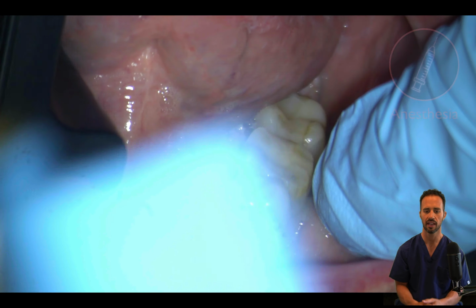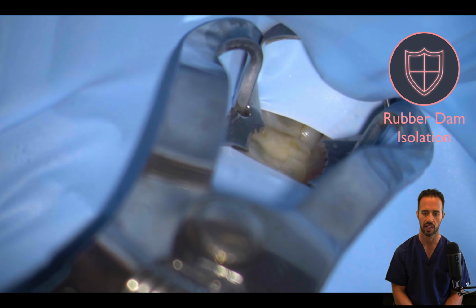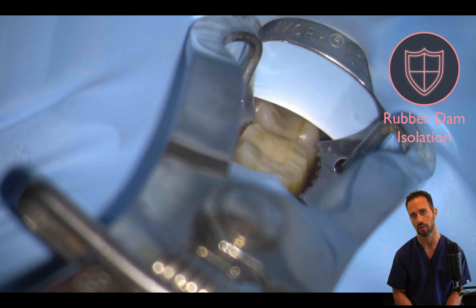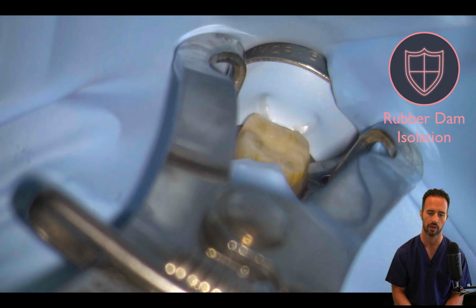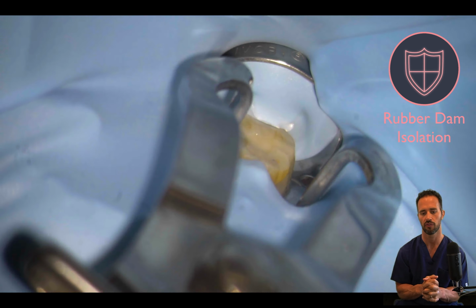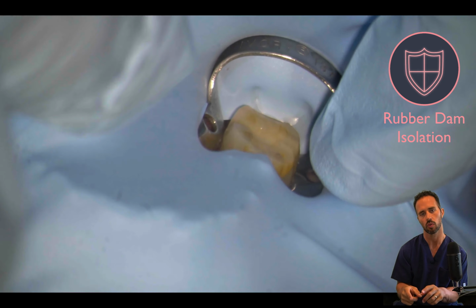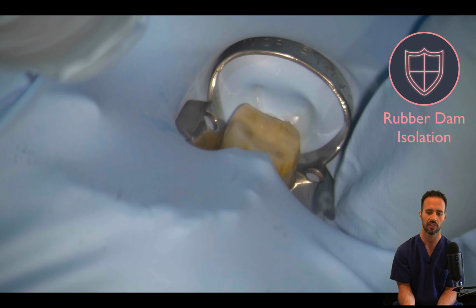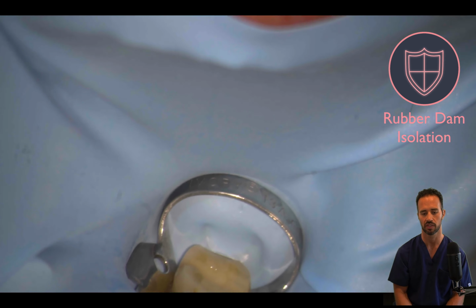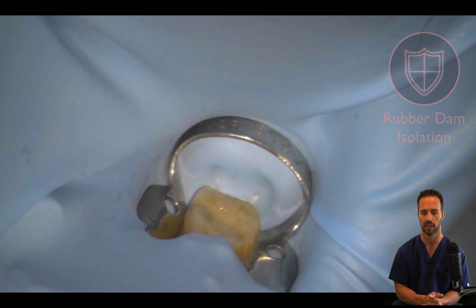So bite blocks in, and we're going to go forward with our rubber dam isolation. This is again a number 13A clamp, single tooth isolation. We just place it right over the tooth. This is some nice video footage of placing the rubber dam, and then we're going to use either our fingers or the paddle instrument to relieve the wings of the rubber dam material, and there you have it, rubber dam isolation in 5 seconds.